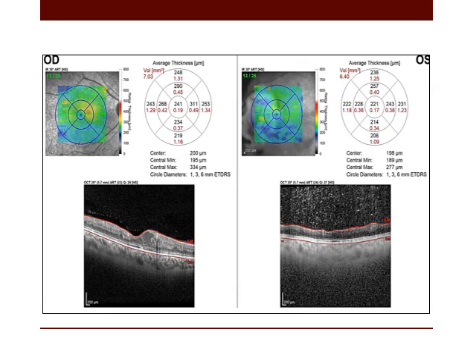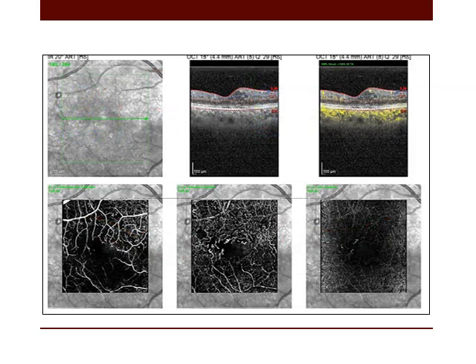Another patient with central involving cystic thickening in this eye, ischemic macula in the fellow eye with vitreous hemorrhage. But the patient complains of this eye. Why? Because there are many ischemic changes detected both in the superficial and deep capillary plexuses.